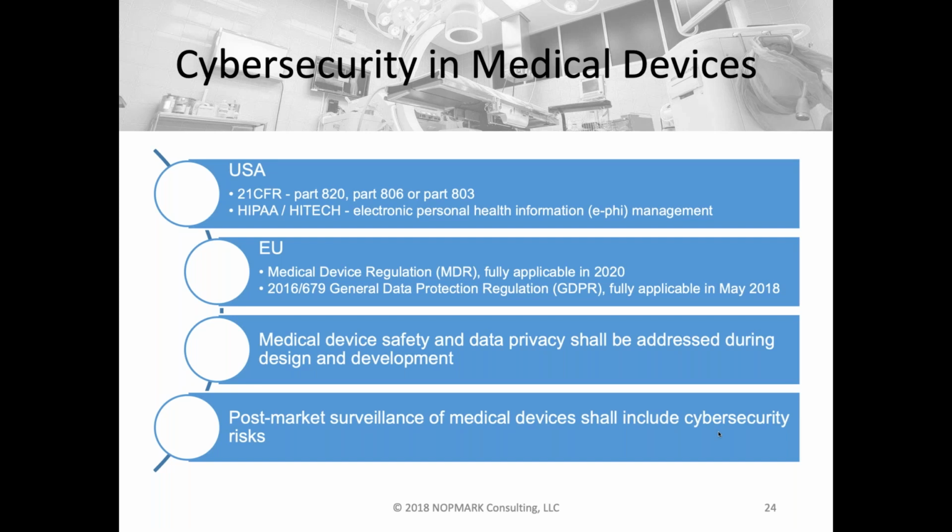And of course, if we're talking about cybersecurity, we're talking about software. And if we're talking about software, that means testing for cybersecurity, using tools to assess cybersecurity vulnerabilities. It's an area where, as part of a tester's test plans, you do have to focus a lot of effort. And because typically you do not have clear functional requirements around cybersecurity, from a testing perspective you're looking at it from a non-functional aspect: how do you test cybersecurity within your software?